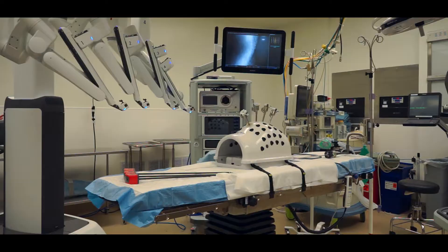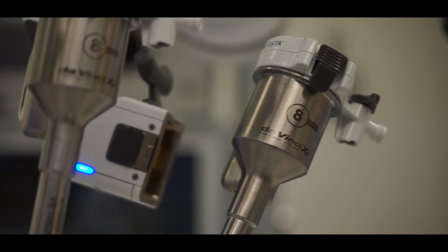Hi, I'm Dr. Sevan Stepanian. I'm a urologist here at Henry Mayo, and we're here in the operating room with the newest surgical tool that Henry Mayo has brought to the community. This is Intuitive's DaVinci XI Surgical Robot.